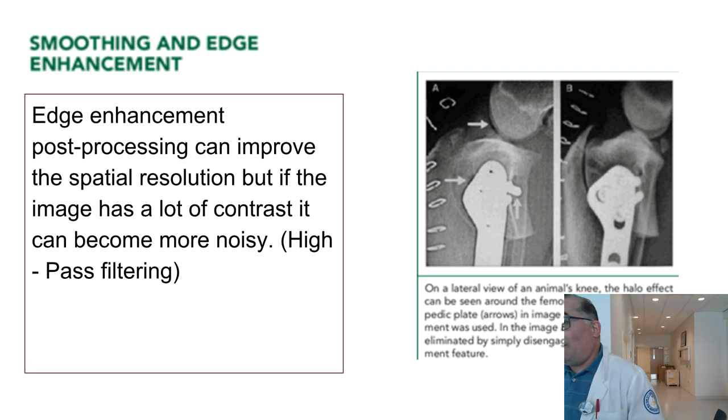And when you want to do other fancy things, you create another data set. So you keep multiplying the original exposure data to give you more data, which means you have more to save and more memory that you need to use. So it compounds on each other. But radiologists have the ability to look at multiple images and go back at least to the basic image data, and in some cases the raw data, maybe if it's still available. So I don't know which one's better.